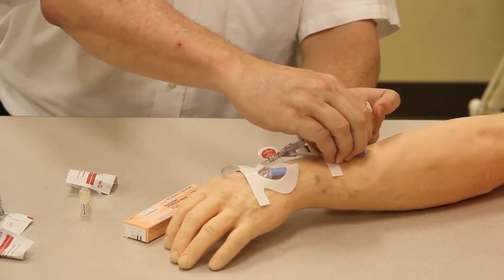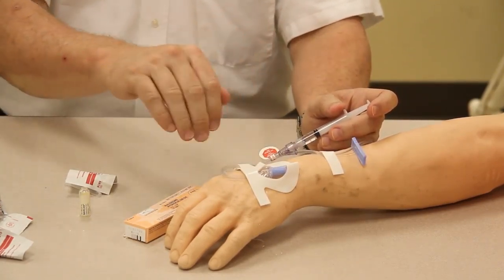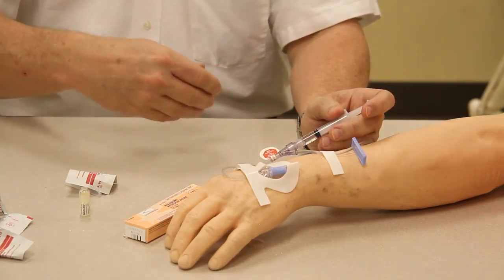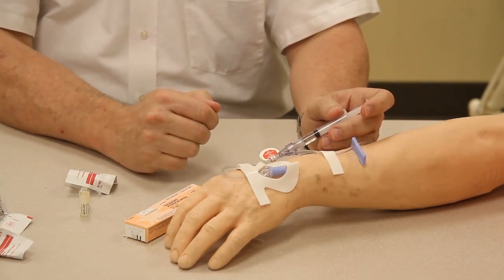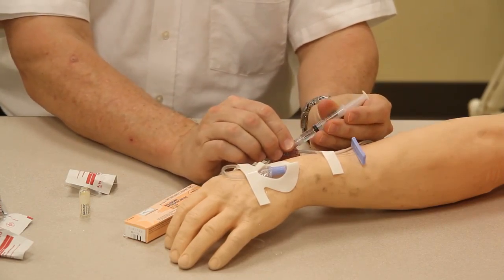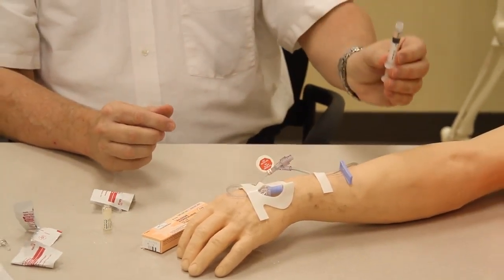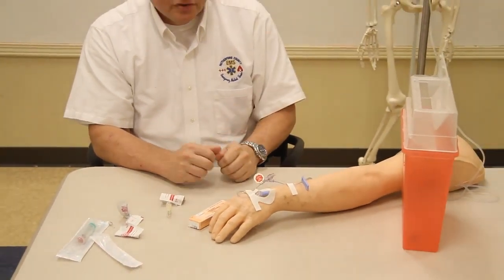Now I'll give half the medication, then I'll open it up and let it free flow into the patient, again making sure that I'm watching patient condition. If the patient needs the rest of the medication, I'll repeat that procedure. Then after I'm finished and my respirations are normal, I'm going to remove the luer lock, make sure of how much medication I've given, and then dispose of the medication.